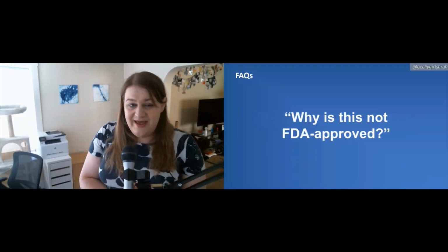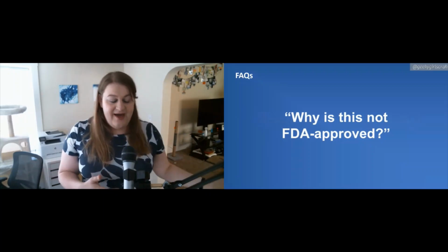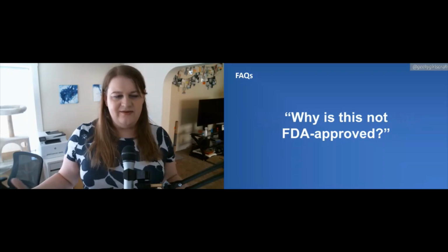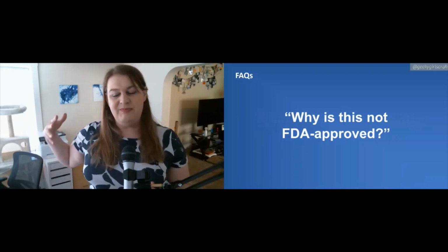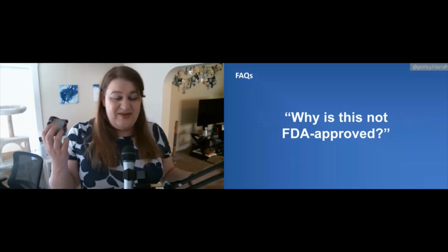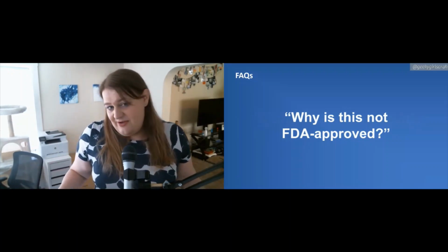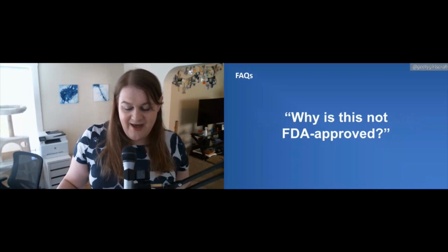Why is this not FDA approved? Yeah, so it's not FDA approved. There's nothing to sell because it's all open source. It's not a product people are buying. These are just IoT device things you can just go and buy. They can be used for anything. We just happen to use them for pancreases.